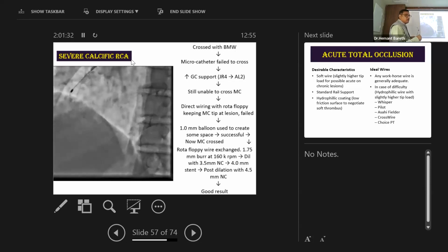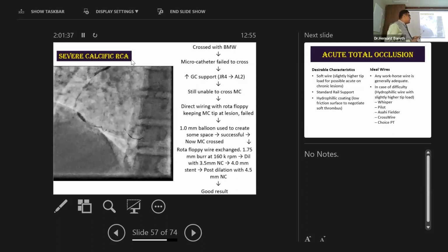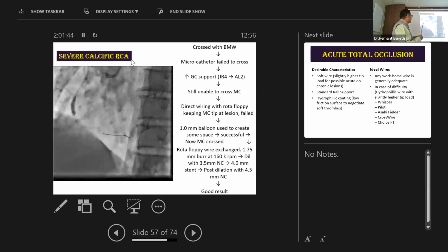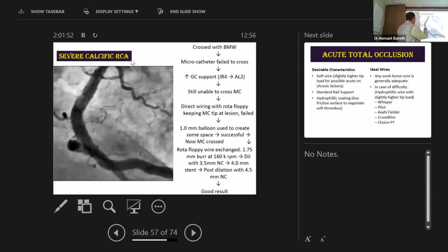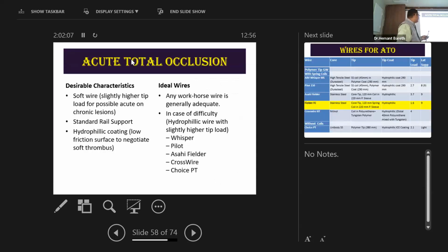And then after rota, with a microcatheter exchange with another wire, or you could put another wire if it is nicely open, then balloon, and now a nicely prepared lesion, ballooning different parts. Post dilating after rota is very important. And then this is the final picture. So you can see that because the vessel was straight, this magnified view was done to see whether there is any tortuosity at all. And because there was no tortuosity at that point, that is why the rota wire was taken, and that is how it was done.